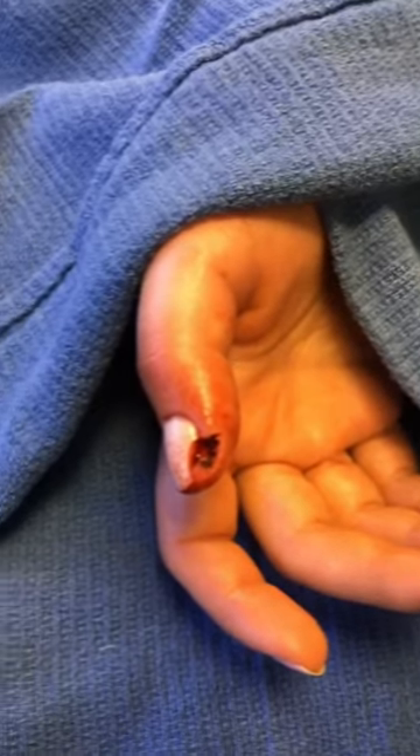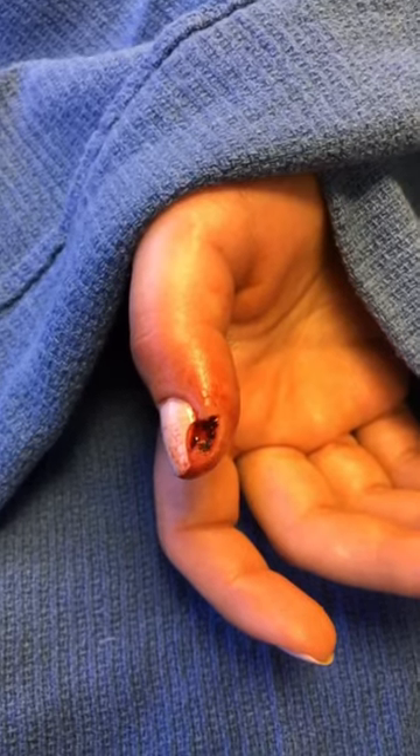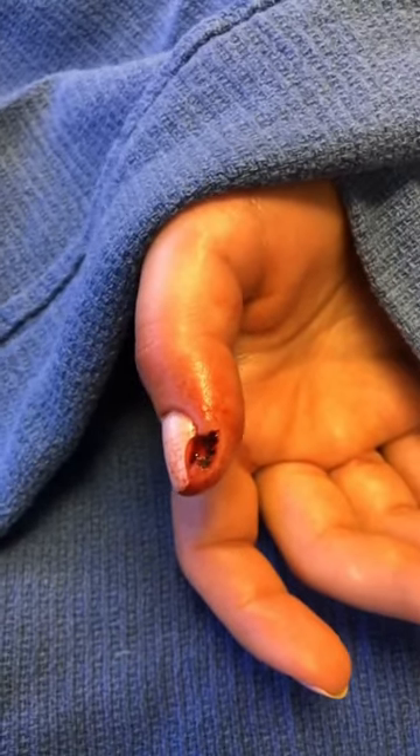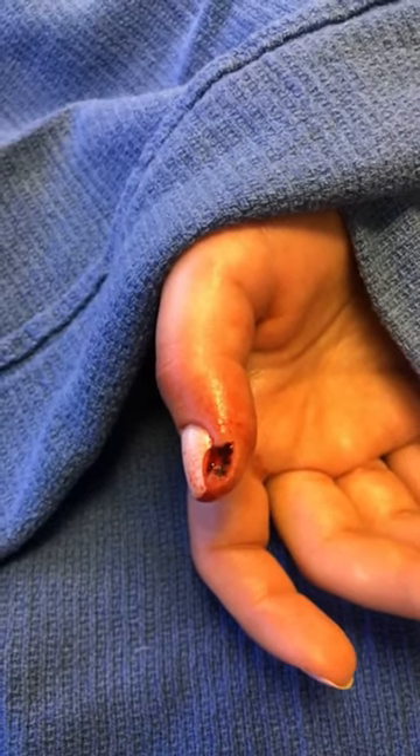So here we are. We have our patient. She was trying to cook and she chopped off a piece of her skin and fingernail. We're going to attempt to save the finger. Stay tuned.